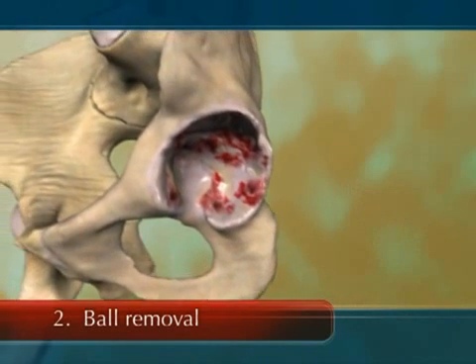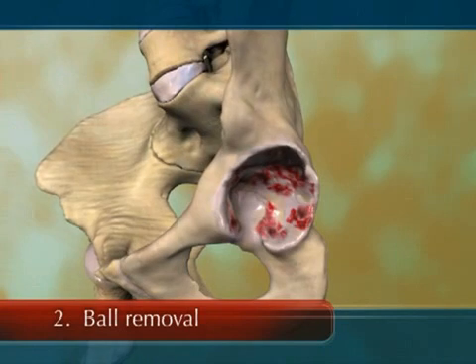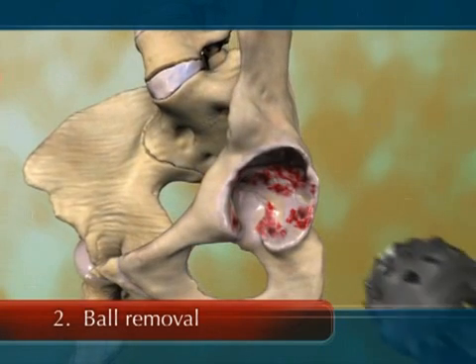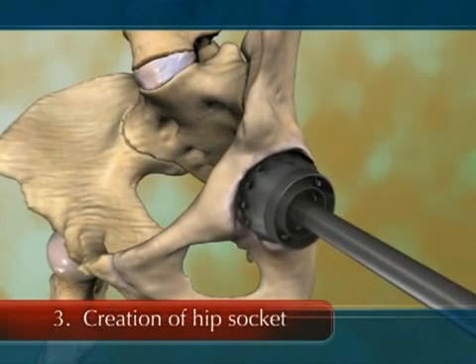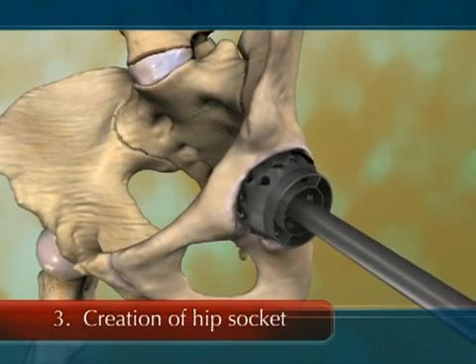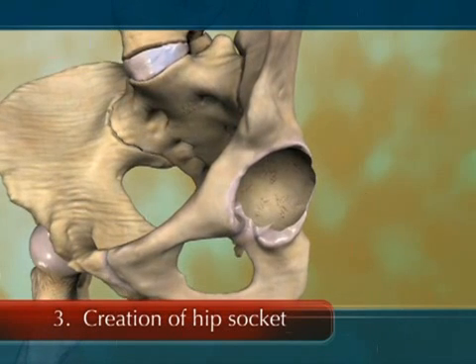The socket, or acetabulum, is exposed. After measuring the size of the socket to guide accurate selection, the appropriate reamer — a cheese grater type device — is used to create a perfect hemispherical bone socket that matches the external shape of the acetabular cup.